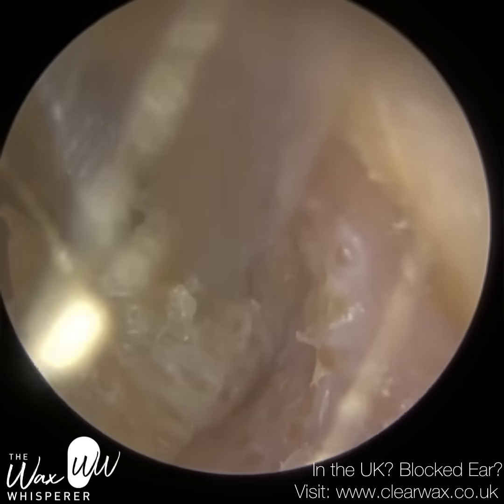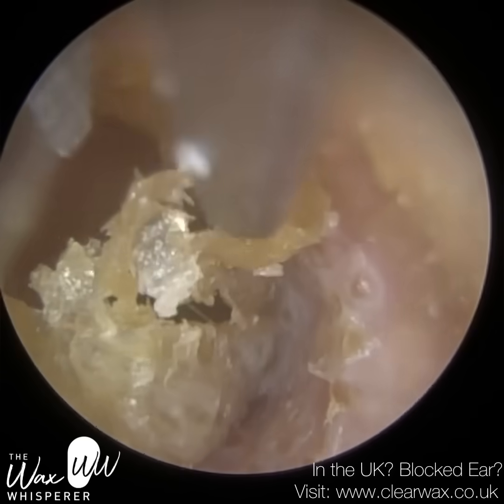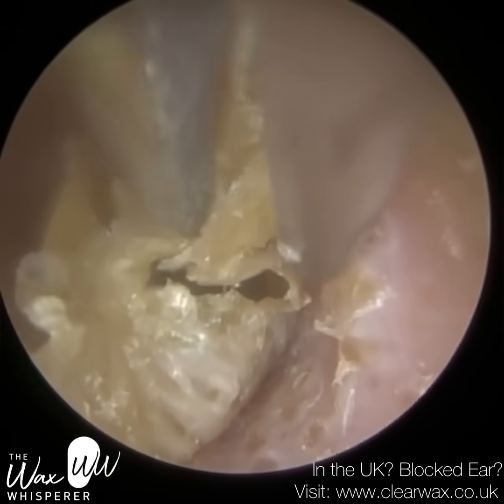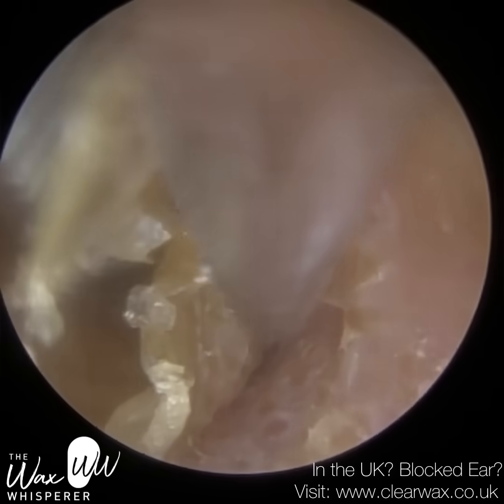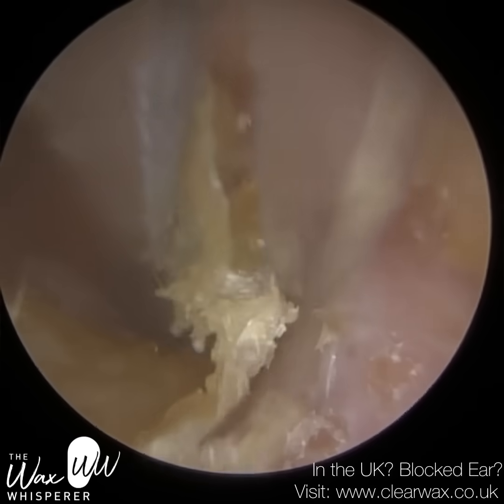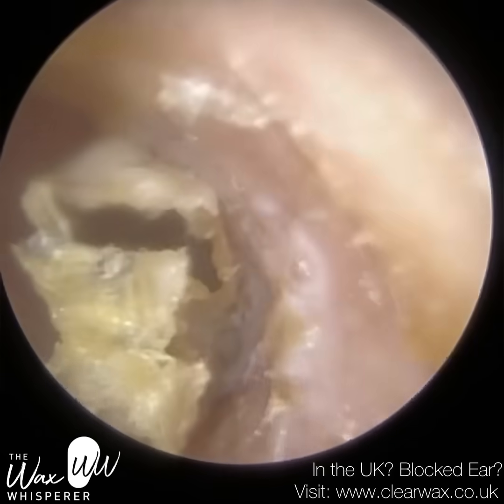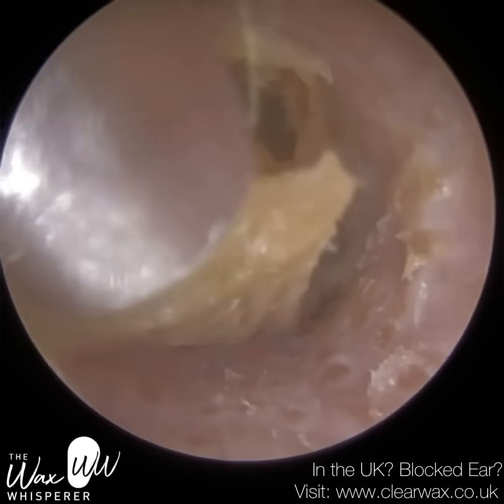I've peeled a lot of it — it's quite a thick blanket. They had it at a narrow entrance of the ear, which makes it a bit difficult when you use forceps, but I'm just trying to get some purchase, and the forceps did come good in the end. It's just getting that grip on the underside. I don't want to introduce any drops in there to soften this skin, because some fungi strains can feed off the olive oil and exponentially grow, so we want to avoid that.